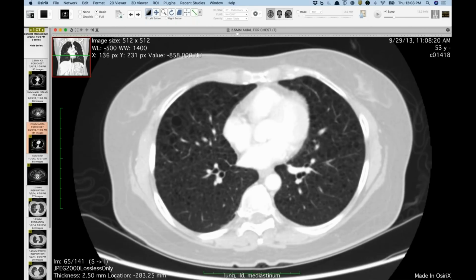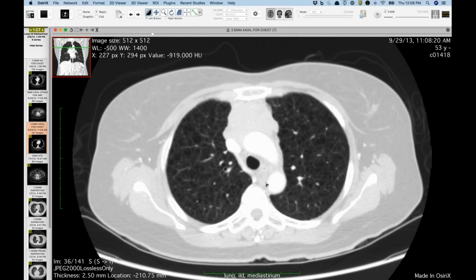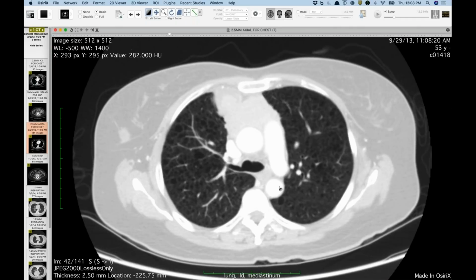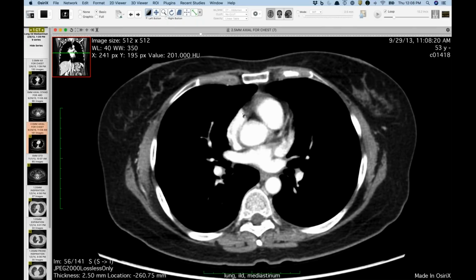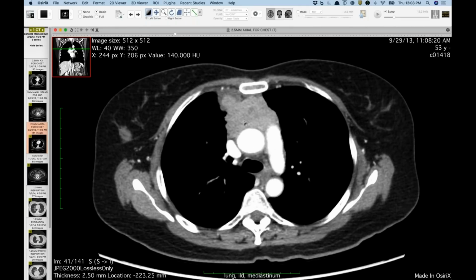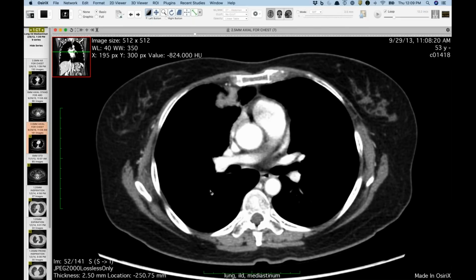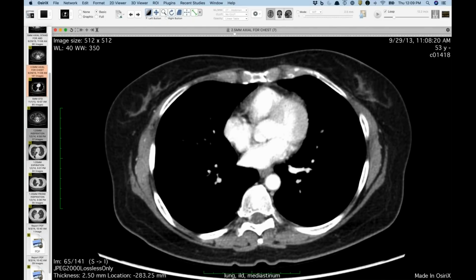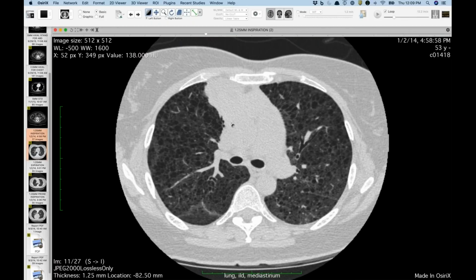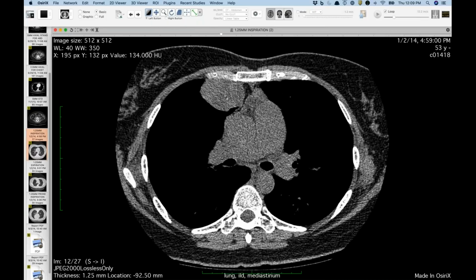I'll show this one. Certainly this looks like LAM. It's a good look for LAM, which is what this lady has. It goes with her lymphangioleiomyomas of her retroperitoneum. But what was interesting was this was done outside, and this was called likely a lymphangioma or lymphangioleiomyoma of her anterior mediastinum at the outside hospital. I think they had a little bit of anchoring bias based on knowing the prior pathology. When she came to us for referral at our ILD conference, I was quickly saying I'm not so convinced of that.